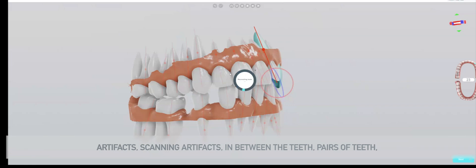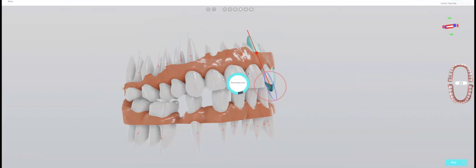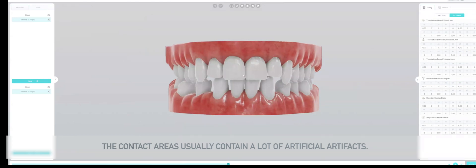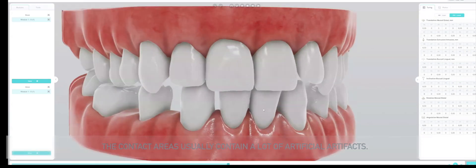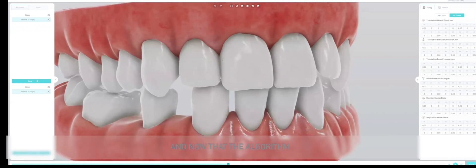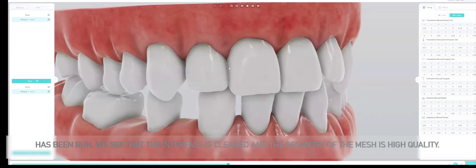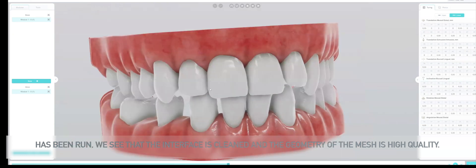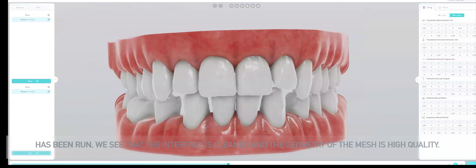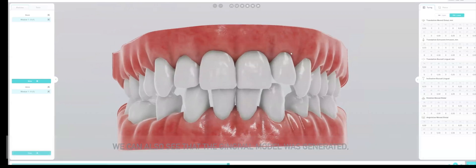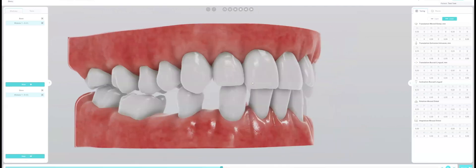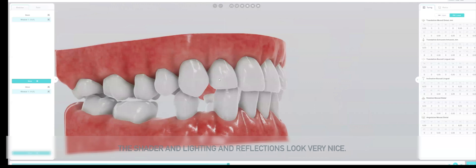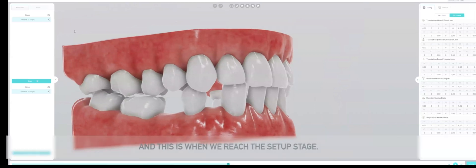We remove artifacts, scanning artifacts in between the teeth, in their contact areas. The contact areas usually contain a lot of artificial artifacts. Now that the algorithm has run, we see that the interface is cleaned and the geometry of the mesh is high quality. We can also see that the gingiva model was generated, and the gingiva model is realistic. The shader and lighting and reflections look very nice, and this is when we reach the setup stage.